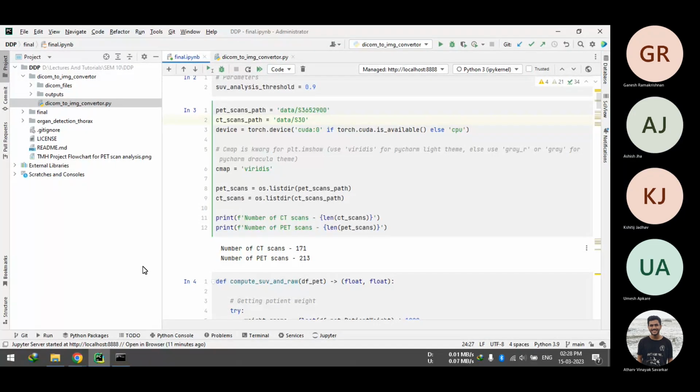Okay. So which algorithm are you using to identify the organ? Right now, I am just hard coding it using bounding boxes. But why, if you use labeled data, you can use deep learning to identify organs? Yes, I'm saying you can use deep learning, but this is much easier and much more robust. Creating bounding boxes and hard coding it is more robust, because the relative position of, for example, the heart in a patient will always remain the same in a CT scan.